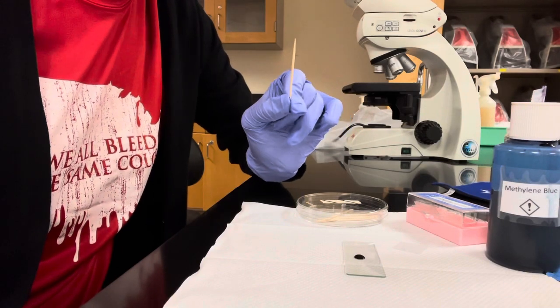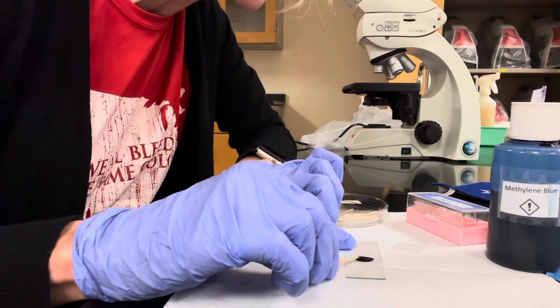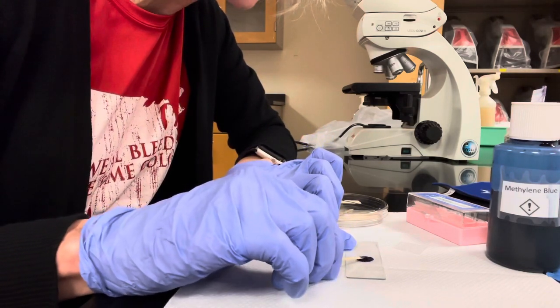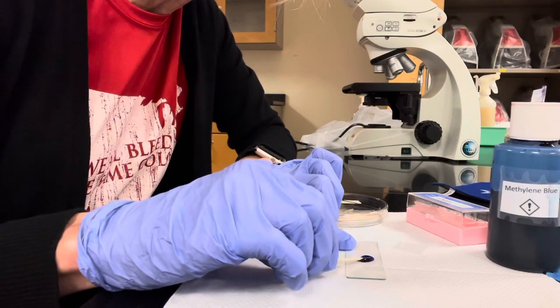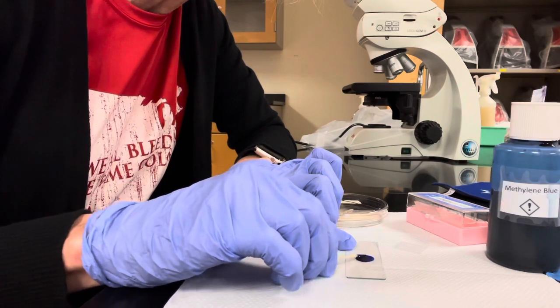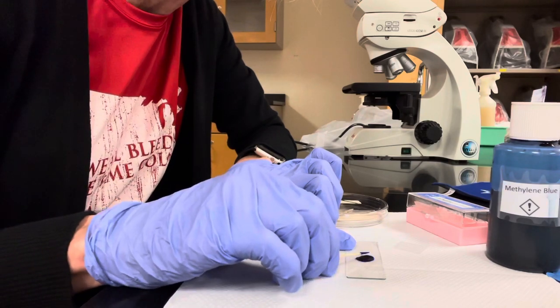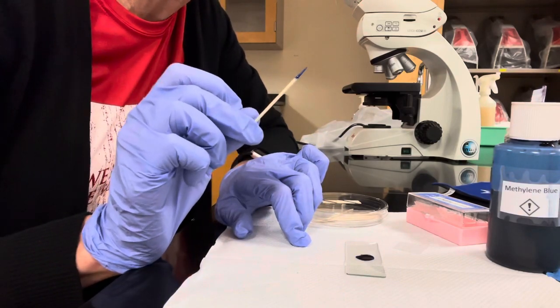Once you scrape the inside of your cheek, you're just going to stir that toothpick, that edge that you grabbed those cells from, into the methylene blue. You're trying to get all of those cheek cells off. Once you're done stirring, you can dispose of your toothpick in the sharps container.